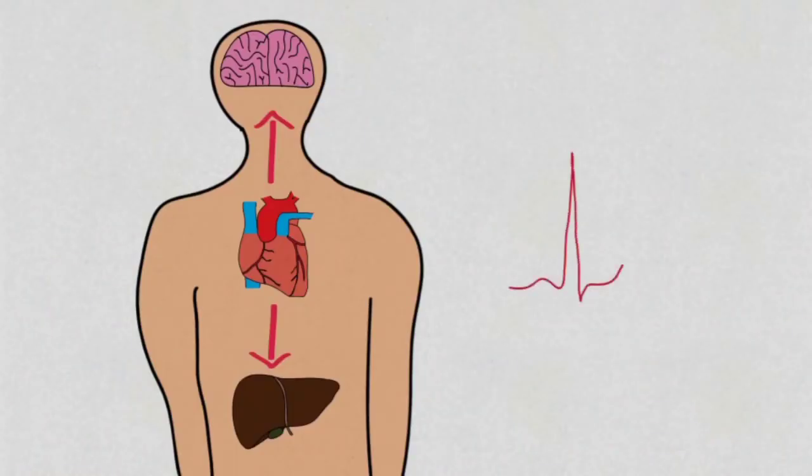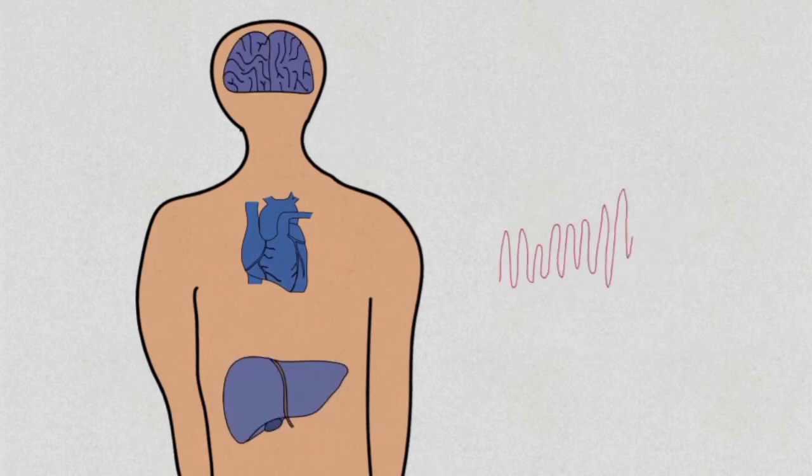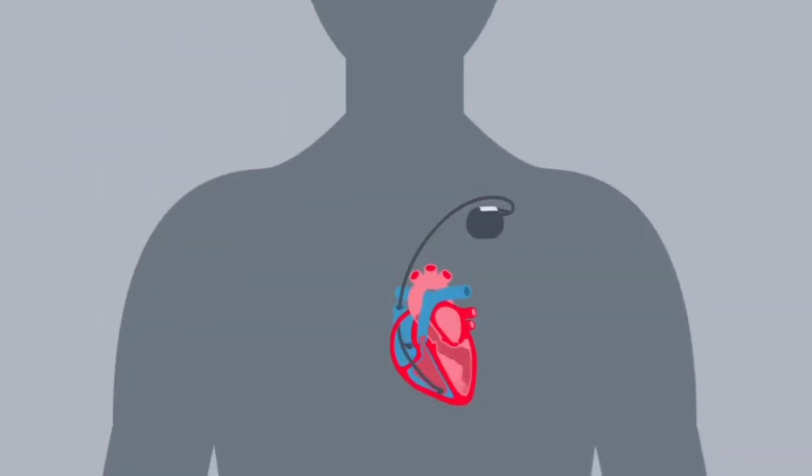In some cases, patients have a high risk for life-threatening ventricular arrhythmias. Therefore, they need an Implantable Cardioverter Defibrillator, or ICD for short. ICD has a role in avoiding cardiac arrests and preventing sudden deaths. It constantly monitors the heart.